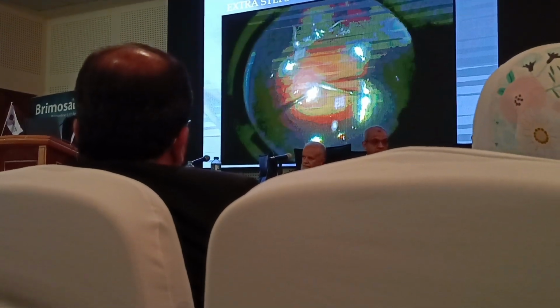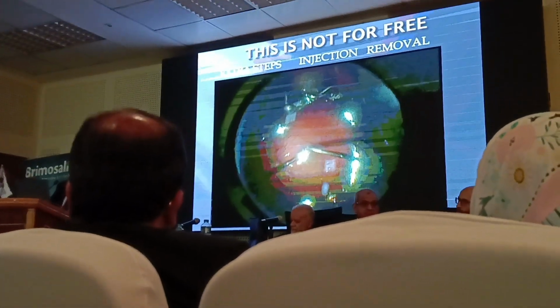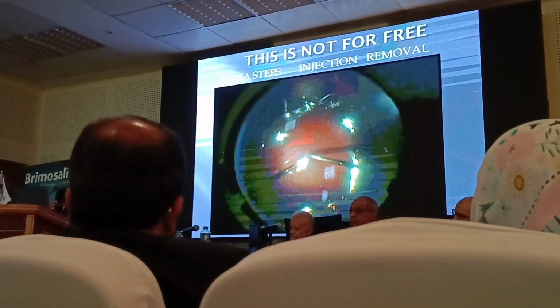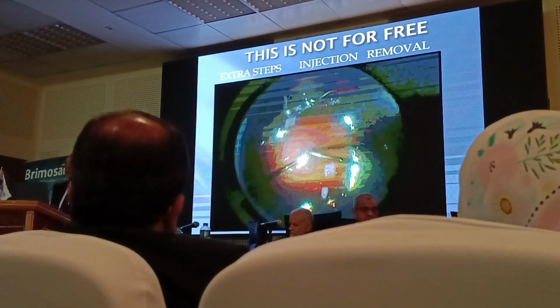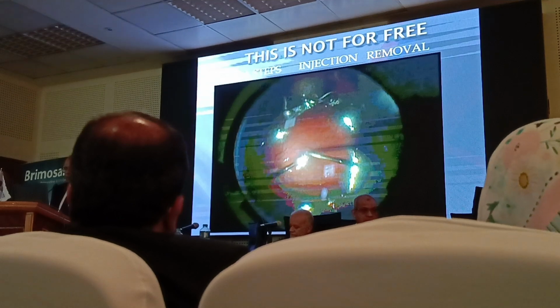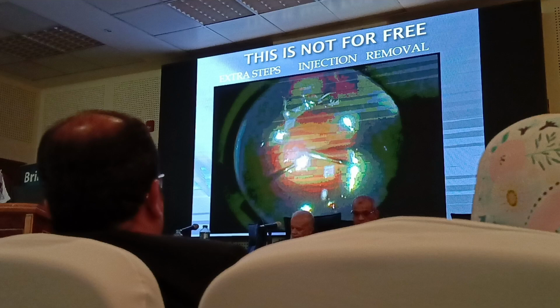If you wait for some time, the normally secreted aqueous will go to the back of the eye and let this globule appear for you. So if you want a complete removal, you have to perform it with a very thin layer of aqueous fluid.